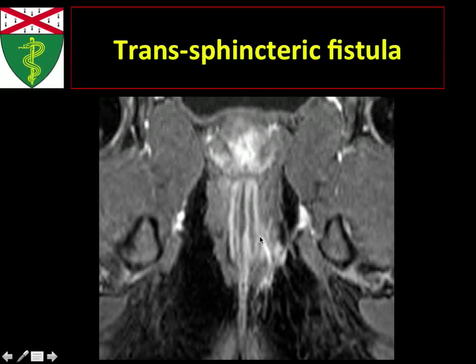And this is what it looks like on the static image. It looks like the diagram that I drew, going all the way downward over here.